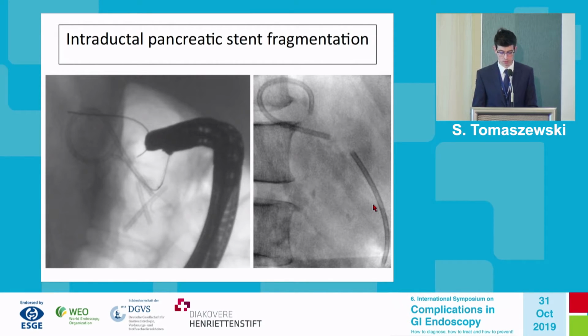As you can see on your left side, there is a fracture in two places with 3 fragments, and on your right side there is a prosthesis that is broken in one place.